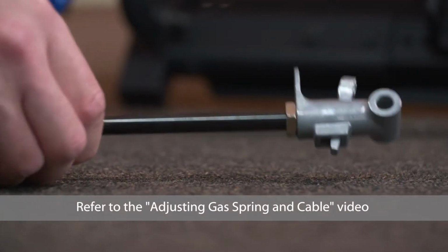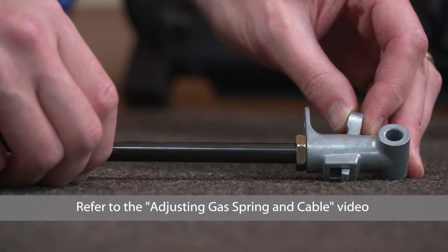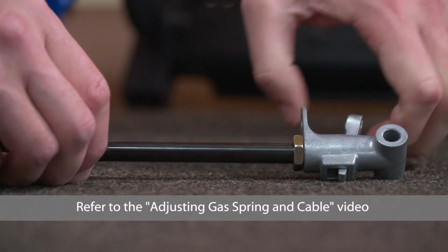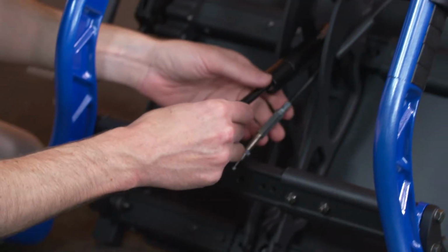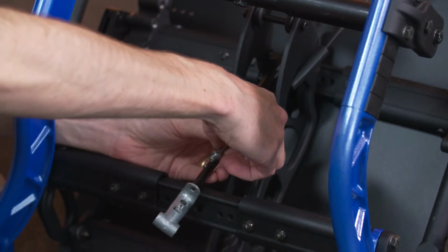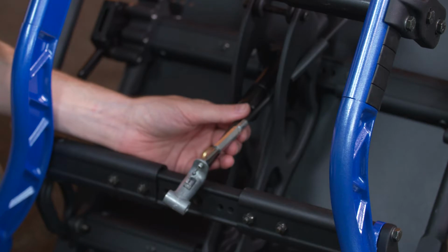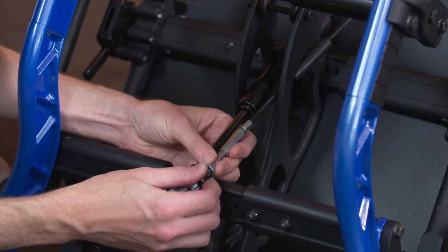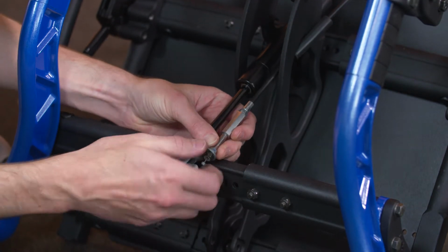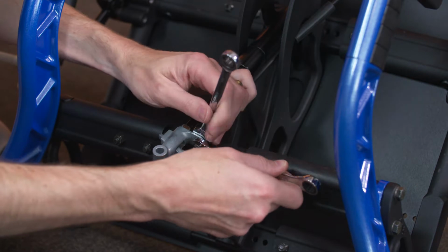Obtain a new gas spring assembly and check to ensure its end fitting and release lever are properly positioned. Refit the cable onto the new gas spring. Reinstall cable mounting fastener and tighten securely.